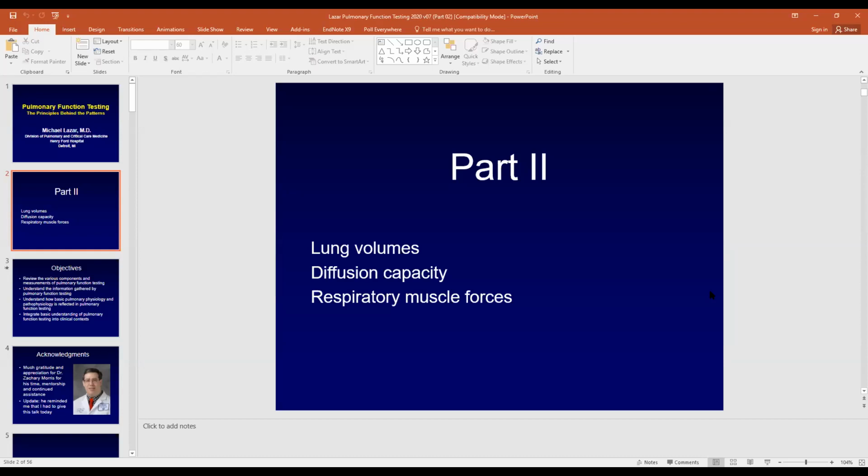I don't know of any studies that do that. I mean, they may be out there. I don't know of any studies that look at it for central airway obstruction. Remember, you'd have to do volumes in those individuals in order to get an airway resistance on them. And I'm not certain if that's ever actually been formally done.